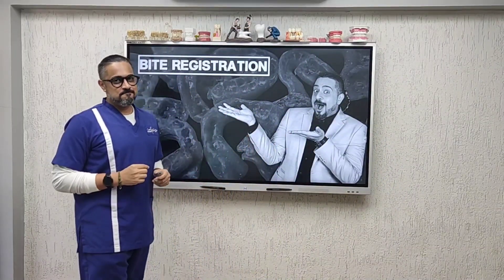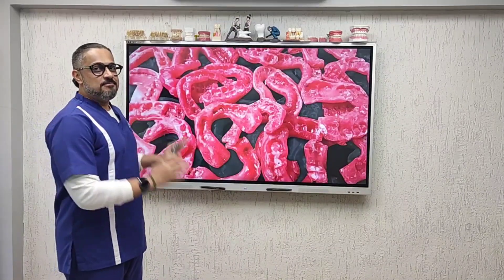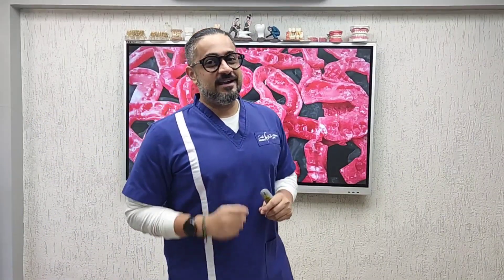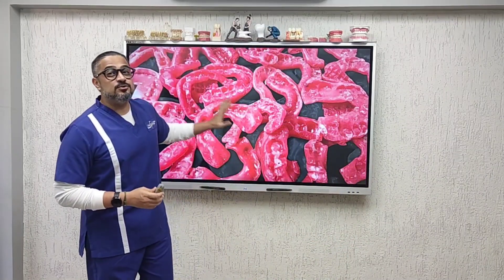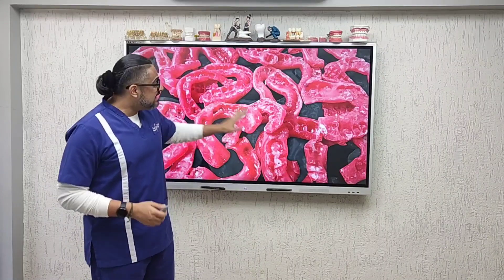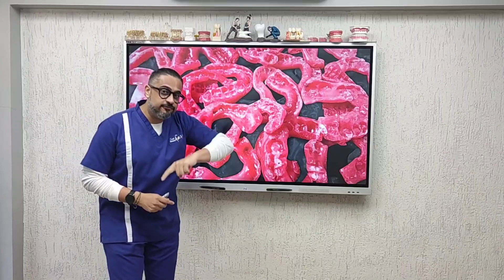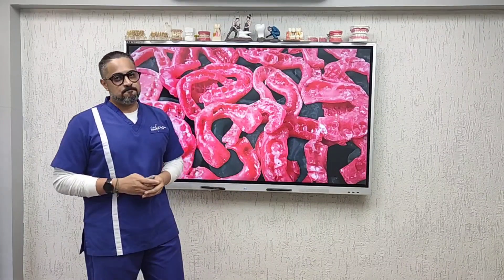This Tipsy Tuesday is about bite registration — a step that is not given due importance. A common sight in a dental laboratory is this, and it hurts to see it because there are two major problems. First, the material used is incorrect: this is modeling wax, which is not accurate enough and distorts. Second, these are full arch bites, which is also problematic.